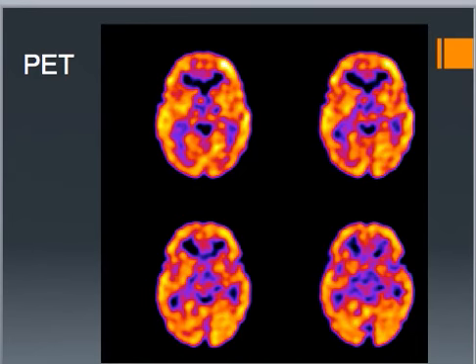So these are some PET scan images of the brain. They'll show the function of the brain. It captures activity of the brain after those radio tracers have been absorbed into the bloodstream. The images appear as multicolored images ranging from dark blue to a deep red. Areas with active brain activity come up in warmer colors like red and yellow.